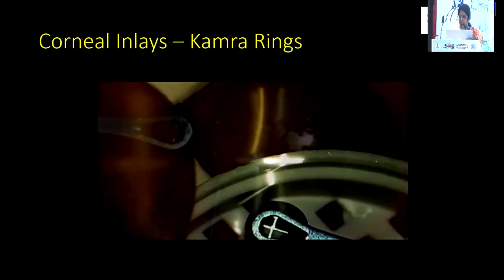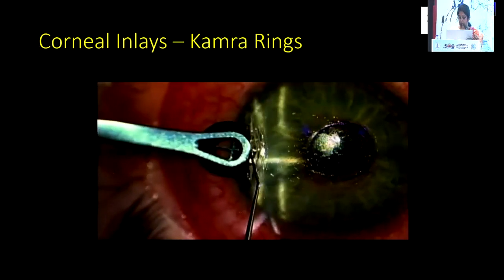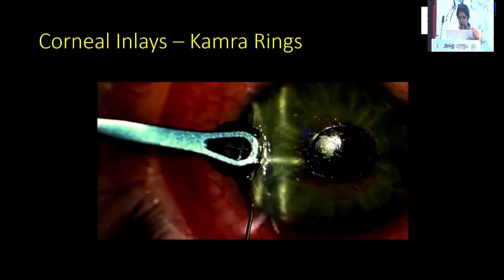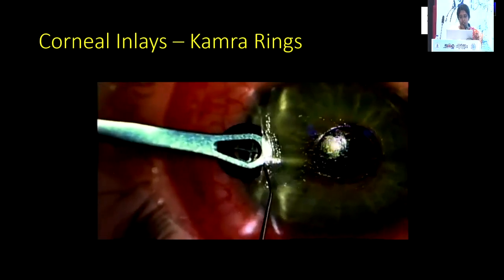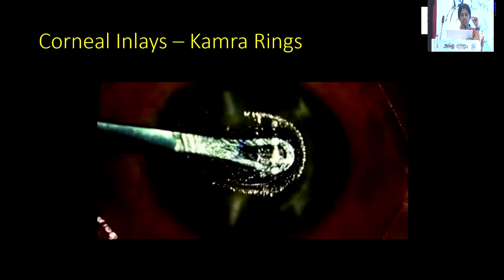Another option is corneal inlay. There are so many inlays like Raindrop, Kamra, everything. But the thing is, with the help of femtosecond laser, we are creating a flap, and that flap is enough to insert that ring.